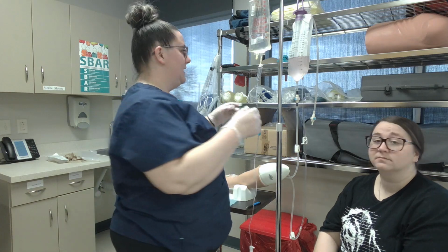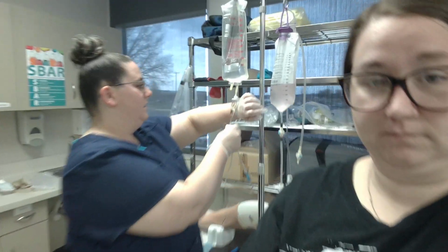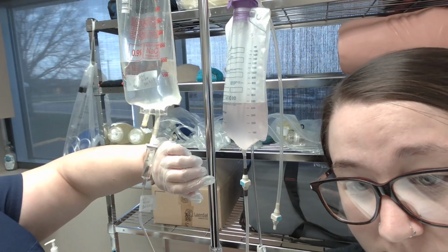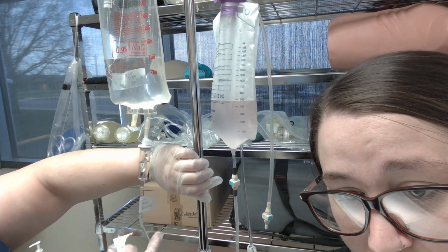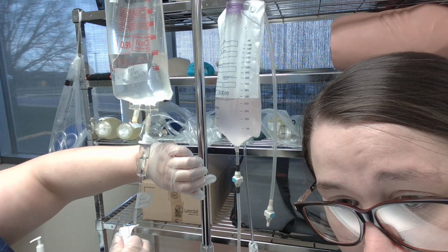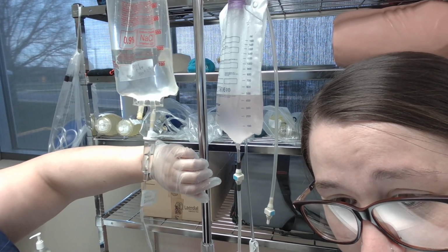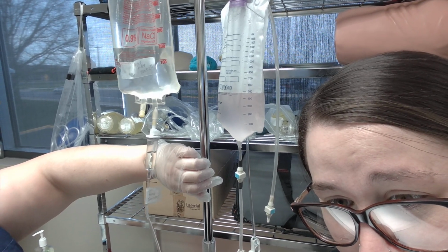Do you want to bring that closer? I can see if I can have the drip rate right. We'll just try. Since I have time. Can you see it? Mm-hmm. It's going to work right. No, I can't get it to. Oh, there it's dripping. Okay.